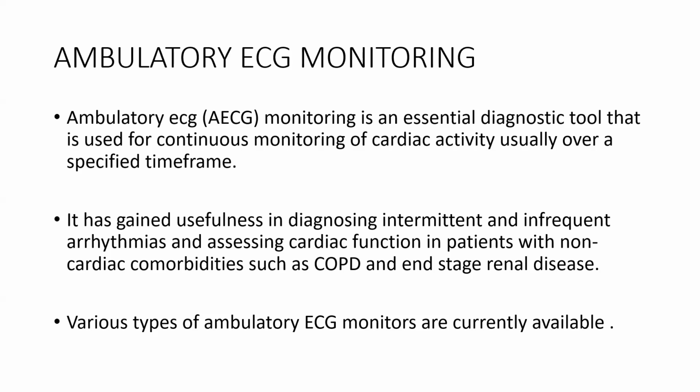It has gained its usefulness in that it's able to diagnose intermittent and infrequent arrhythmias and also assess cardiac function in patients with non-cardiac comorbidities like chronic obstructive pulmonary disease and end-stage renal disease. So various types of ambulatory ECG monitors are currently available.